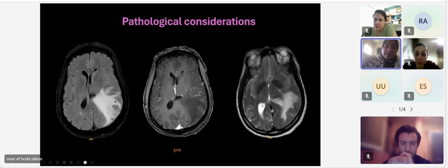It's finger-like. You can see it's subcortical. It doesn't touch the cortex. It's just spreading in the subcortex, and this is in opposite to the cytotoxic. With cytotoxic, you cannot differentiate the gray-white matter junction, and you can differentiate this here. So all of this is like a vasogenic edema from the tumor. Maybe it's low grade, it doesn't have enhancement, and it's just T2 FLAIR hyperintensity. This can happen with low grade glioma.